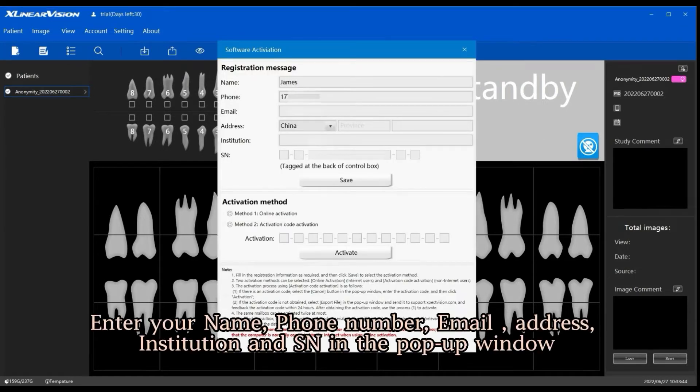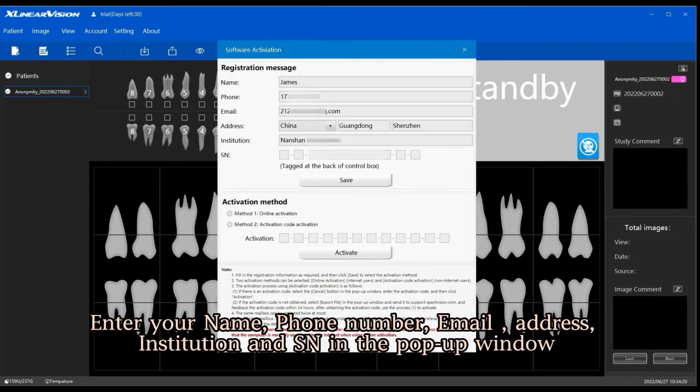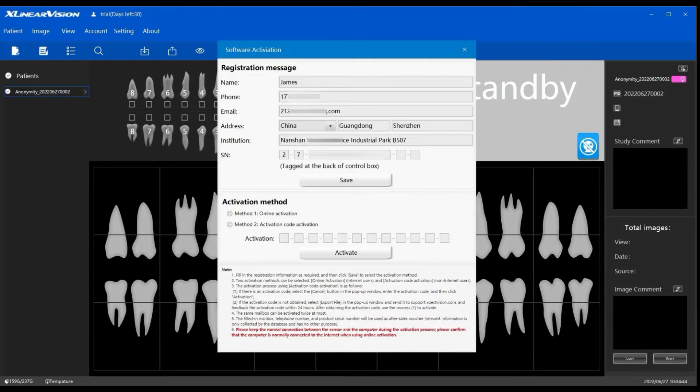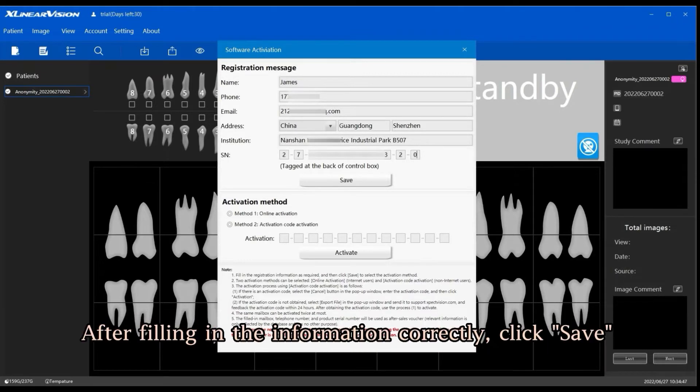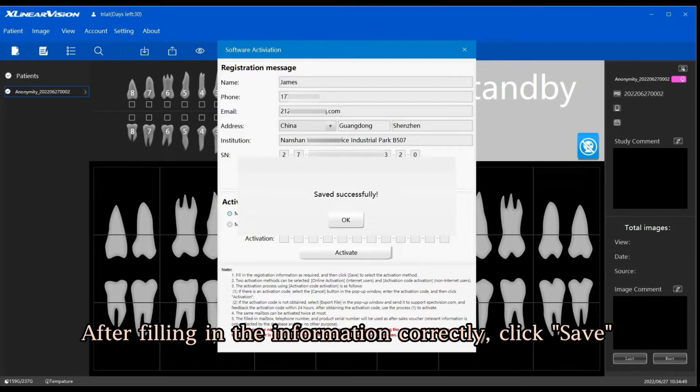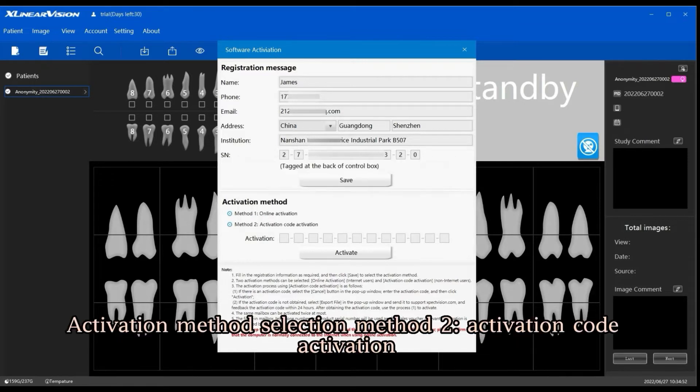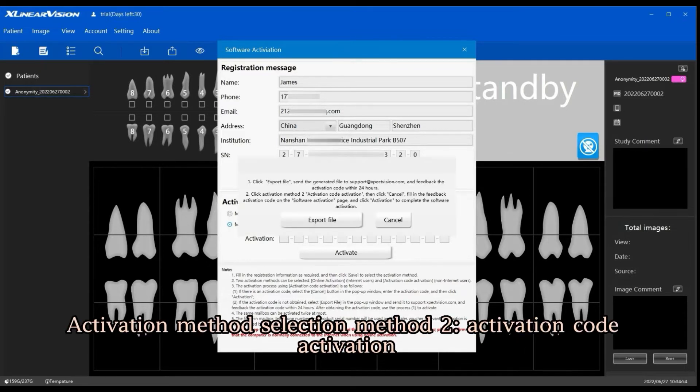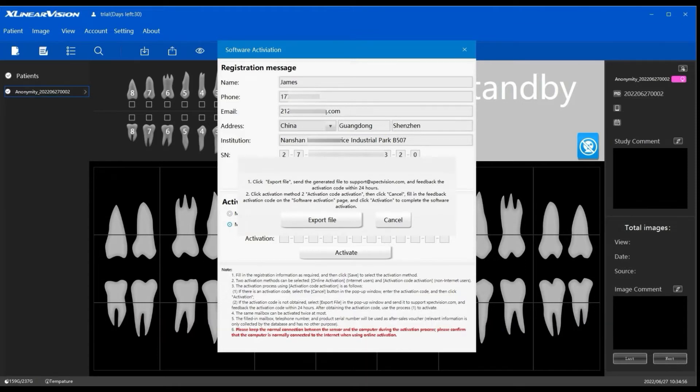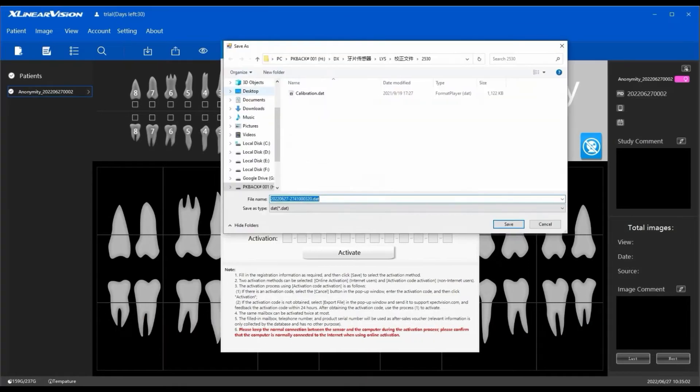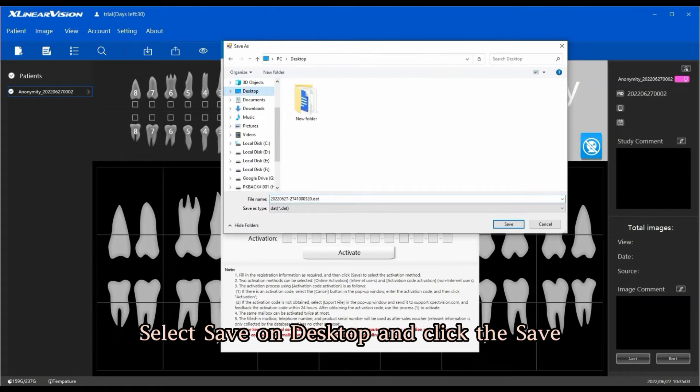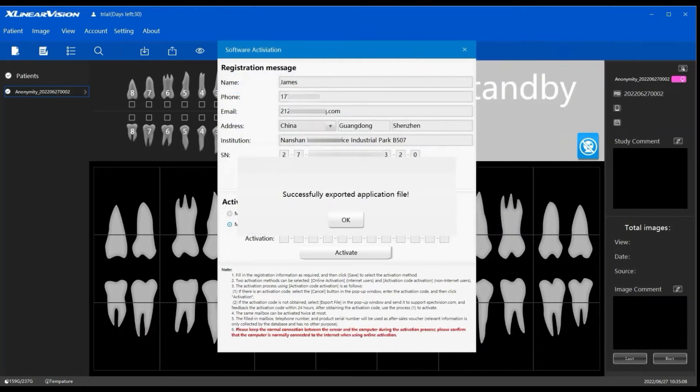Enter your name, phone number, email address, institution, and SN in the pop-up window. After filling in the information correctly, click Save, then OK. For activation method, select Method 2: Activation Code Activation. Click Export File, select Save on Desktop, and click Save, then OK.